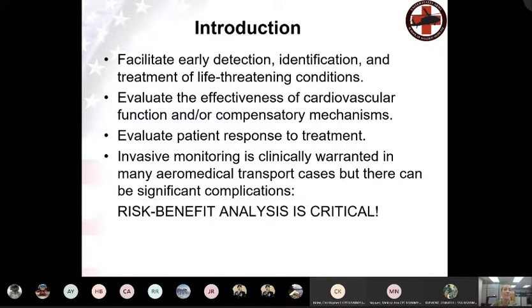Now, having said this, everything that we do has a risk associated, and we must really take a step back and ensure that the risk associated with it is warranted based off of the predominance of benefit from having that intervention.